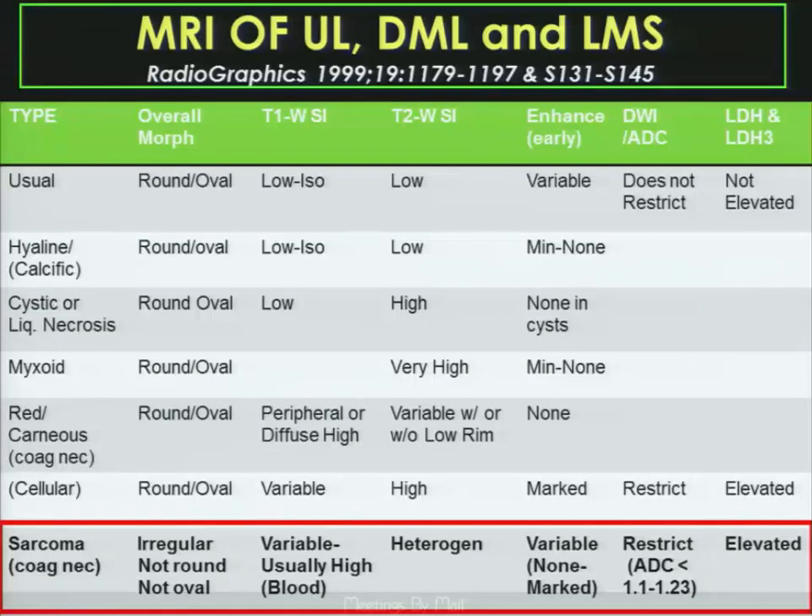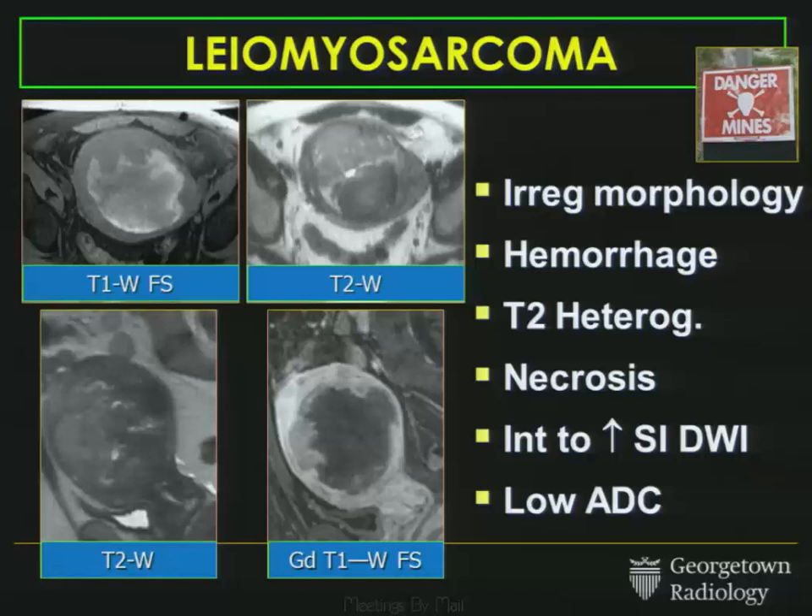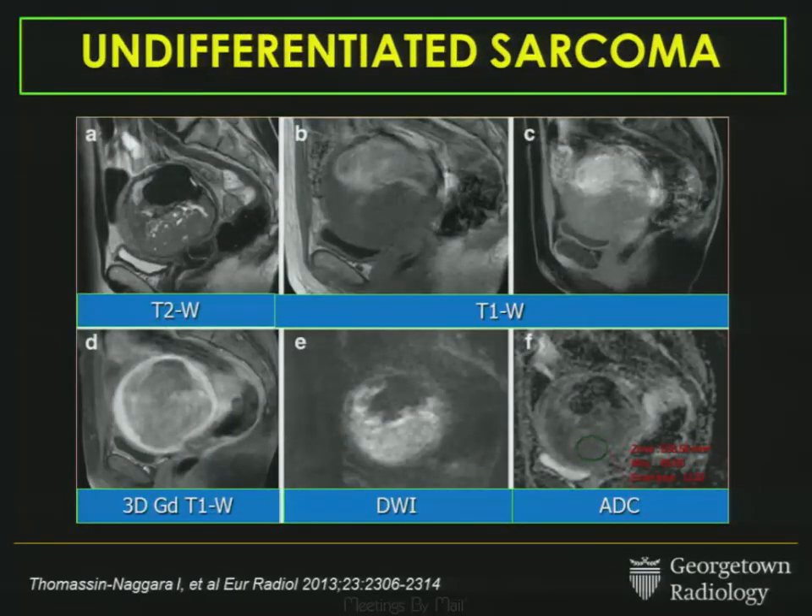Now we can try to fill out the leiomyosarcoma row in the chart — imperfect because these are small numbers from just two published studies. We can say leiomyosarcomas tend to be irregular, not round or oval. They may have heterogeneity on T1 fat-suppressed due to blood products. They tend to be heterogeneous on T2. Some parts enhance early while others are necrotic and don't enhance. They should have restricted diffusion, and it's helpful to use ADC value cutoffs as a guideline. You may also see increased serum LDH. This is from the Thomassin-Naggara paper showing heterogeneity on T2, high T1 blood products, heterogeneous enhancement post-contrast, and restricted diffusion on DWI with corresponding ADC map.